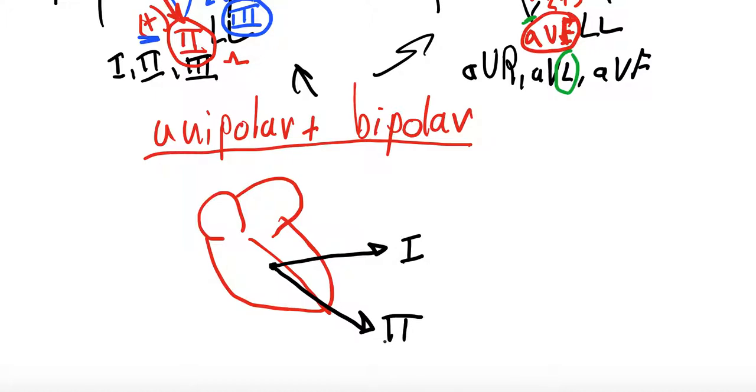So in this direction, it would be positive. And lead 3 of the bipolar leads, if you remember, that was from left arm down to left leg. So this is going to look odd initially, but it actually goes in this direction, a little right of straight down, right? Because we think of our left arm down to left leg. All right, let me just erase these two abbreviations here quick.